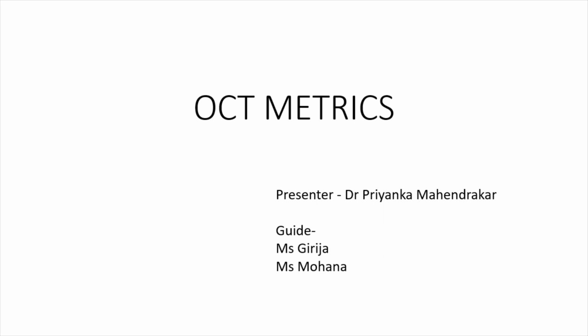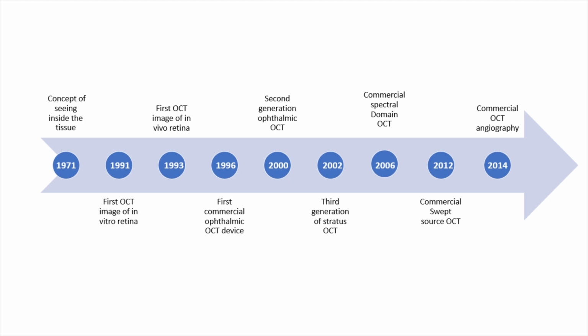Good evening, everyone. I'll be presenting a class on OCT metrics, basically measurements which are possible on OCT. I got help from Girija and Mohana, who are there in our optoms in our OCT section. So, starting from 1971 to now 2014, we have come from first generation, second generation OCT, and then now to the commercial OCT angiography. So there have been a lot of evolution in this field.